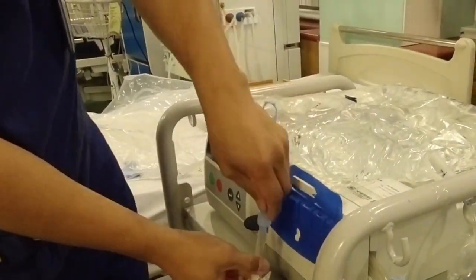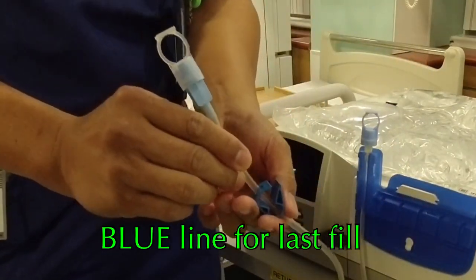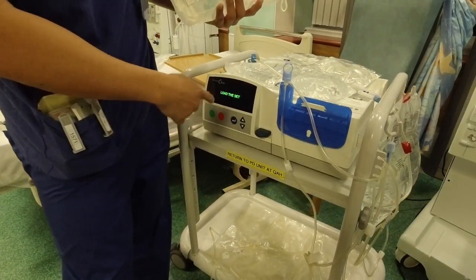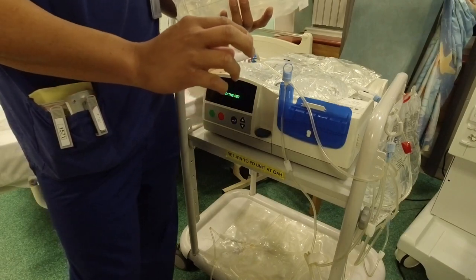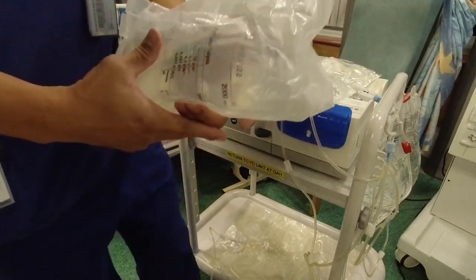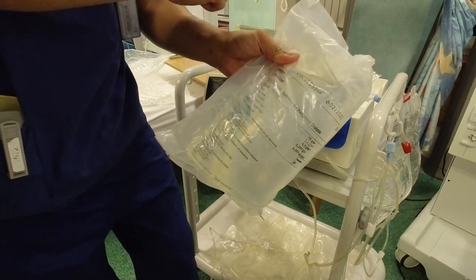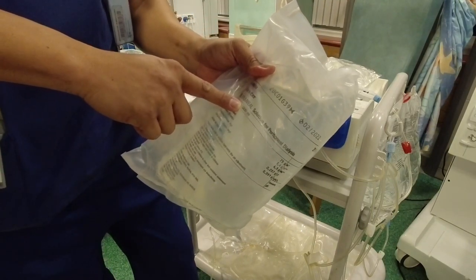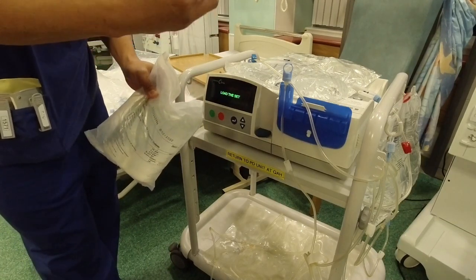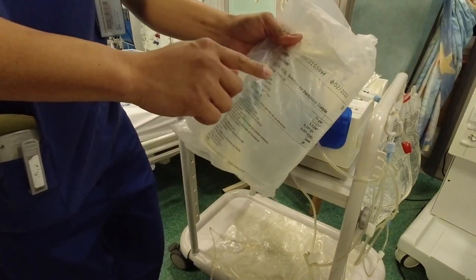And then the last one is, you're gonna use this if you get a last fill. So the blue one is the last fill. So remember earlier on when we set the machine, your last fill says dextrose, different concentration. Different because we're using a different concentration. So that one we're using 1.36 of the Physioneal, and the last fill will be Extraneal, which is a different concentration. So that's why we set it as different. If the dextrose is the same, then we put it on the same bag. I'll show it to you later. So Extraneal.